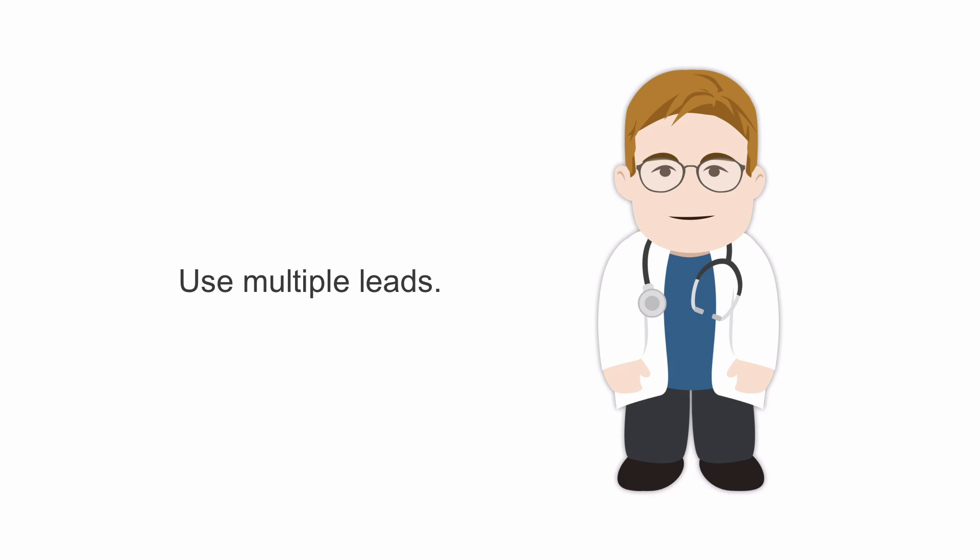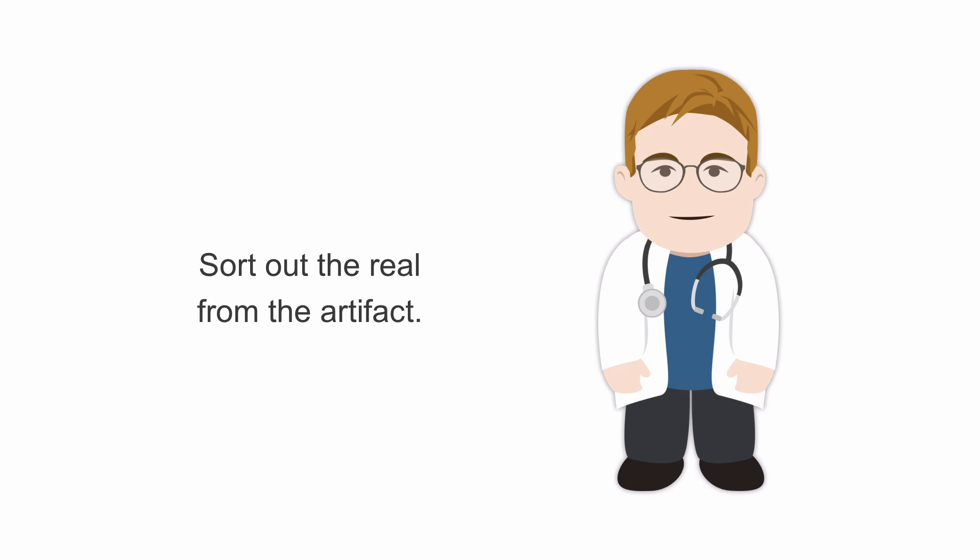So the ST segment is really our key. We can often rely on using multiple leads, but we should use leads that are next to each other. If we have a situation in lead II we want to sort out, let's look at II, III, and AVF. If we're not sure about V1, let's look at V1 and V2. We want to try to read through the snowstorm and find the polar bear by sorting out the real ST segment changes from the artifact.